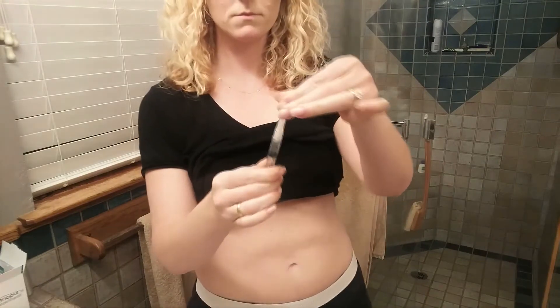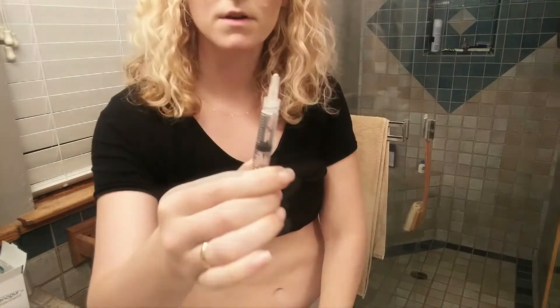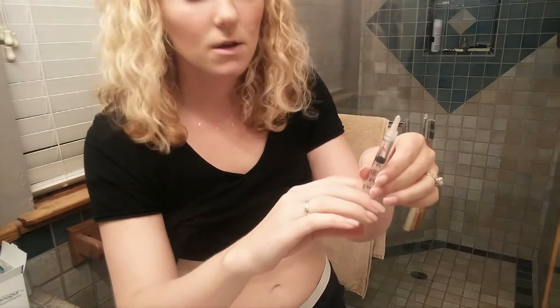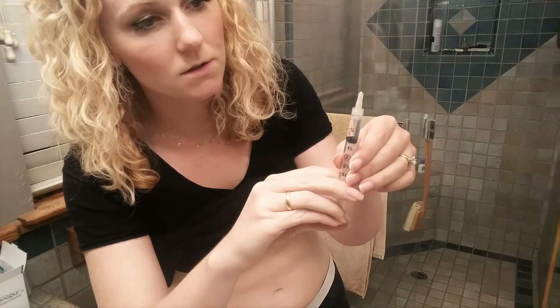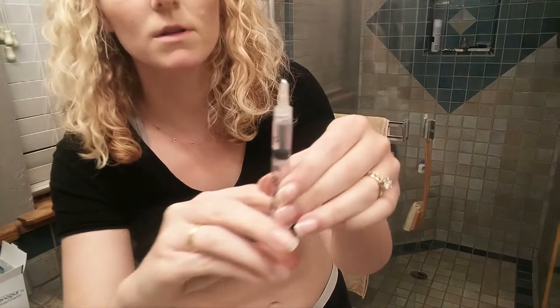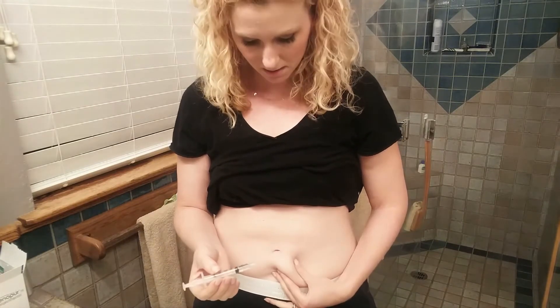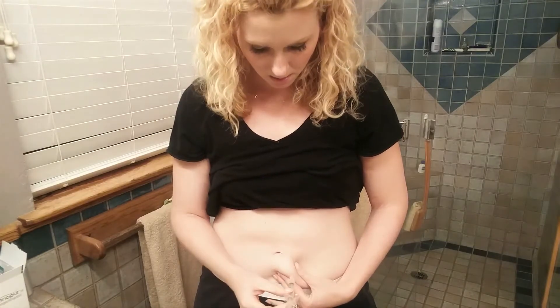Now I put the needle on — take the cap off — can you see the needle? It's teeny tiny, it is. I know it kind of looks big but it's really small. You're going to push up that syringe and you can see the liquid going up it. There was one little drip drop — that's right where you want it, because then you know the liquid is right there. So now we're going to hope that that's dry.